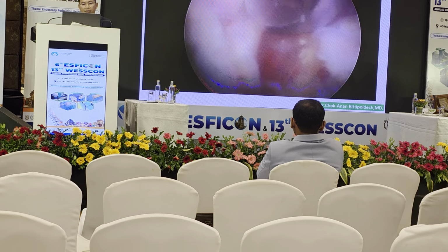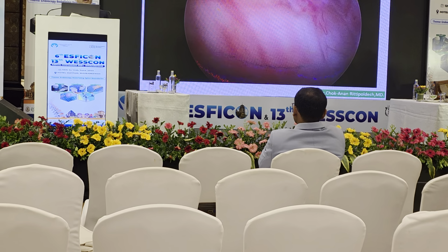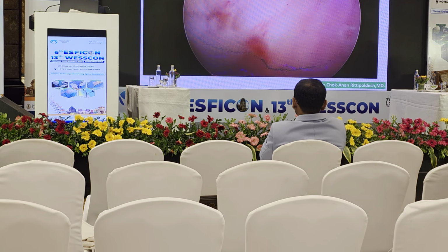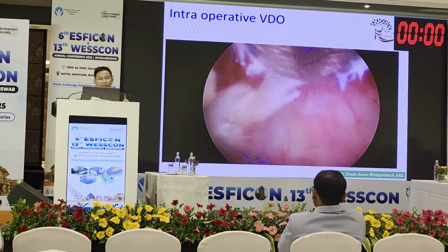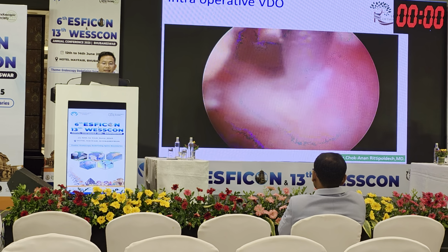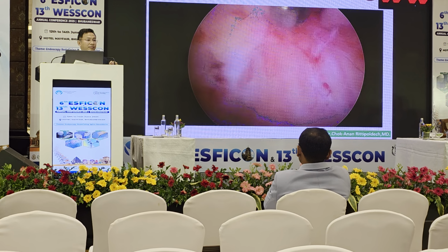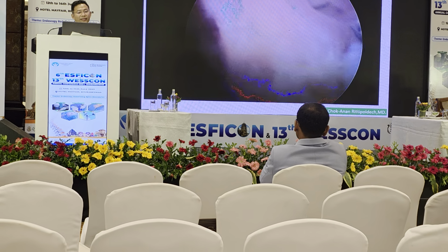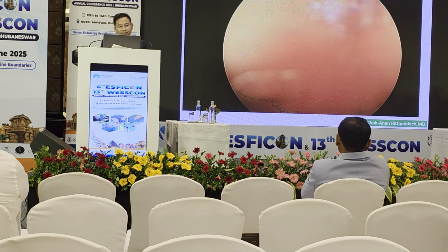For this case, in most of my cases in the cervical spine, per level I use around 30 to 45 minutes. So in most of my cases, I do multi-level decompression through only one approach. But in this case, maybe we cannot do it through only one wound. We have to separate, and you apply the rivet, and it's complete.